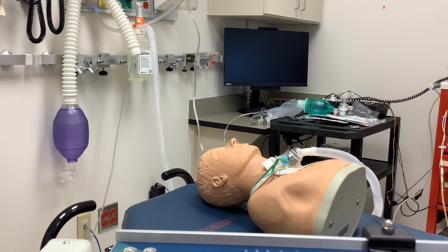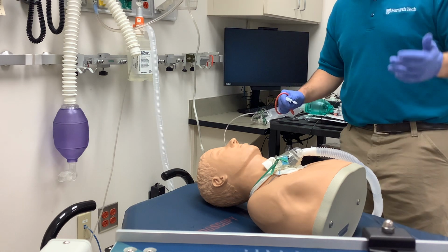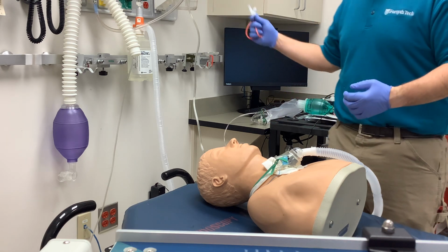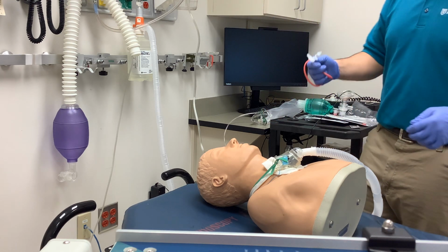All right, so we'll do open suction with the tracheostomy tube patient. Again, I've got the flows and everything off, as well as the vacuum, so that I'm not having to speak over everything. But again, just to reiterate, you'd want to make sure that you're testing your suction pressure, your vacuum pressure.